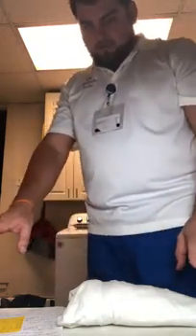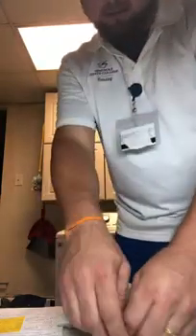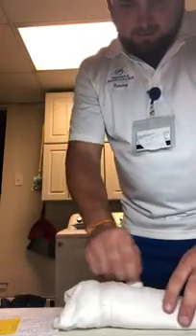So this is now her abdomen. She's laying flat. We're going to go between the iliac crest and the costal margins, avoiding a 2-inch ring around the umbilicus. So that'll be right about here. We've got our alcohol swab again. We're going to clean our area.